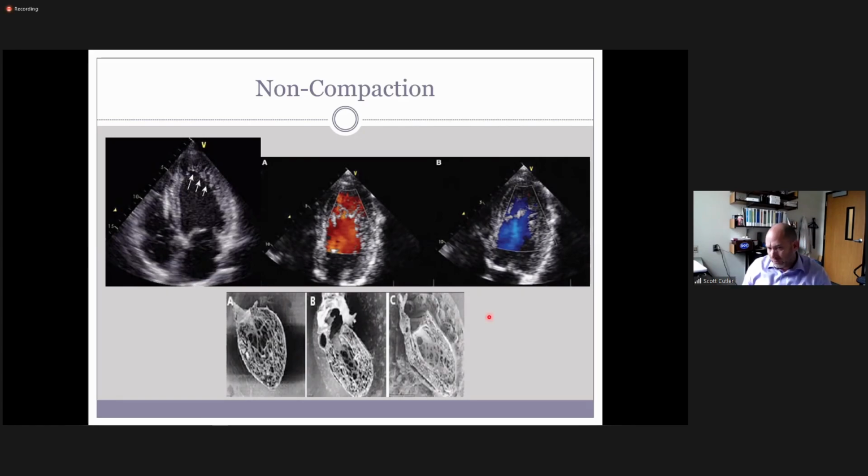Good. You also have the option of power Doppler, which is less direction specific and more intensity specific. So power Doppler could also be useful in that area. But 90% of your echo is the window. A good window first and foremost.